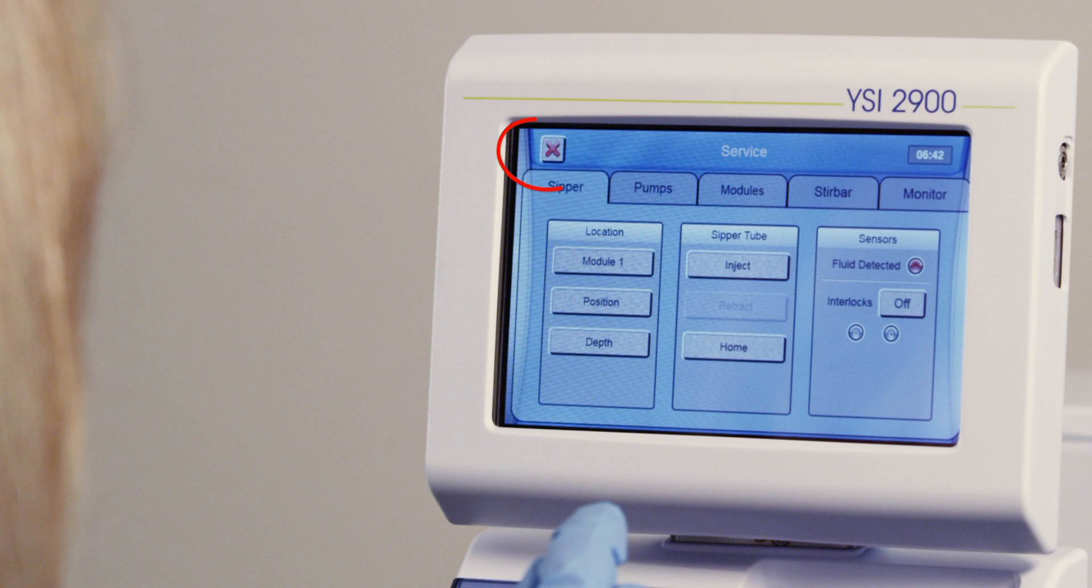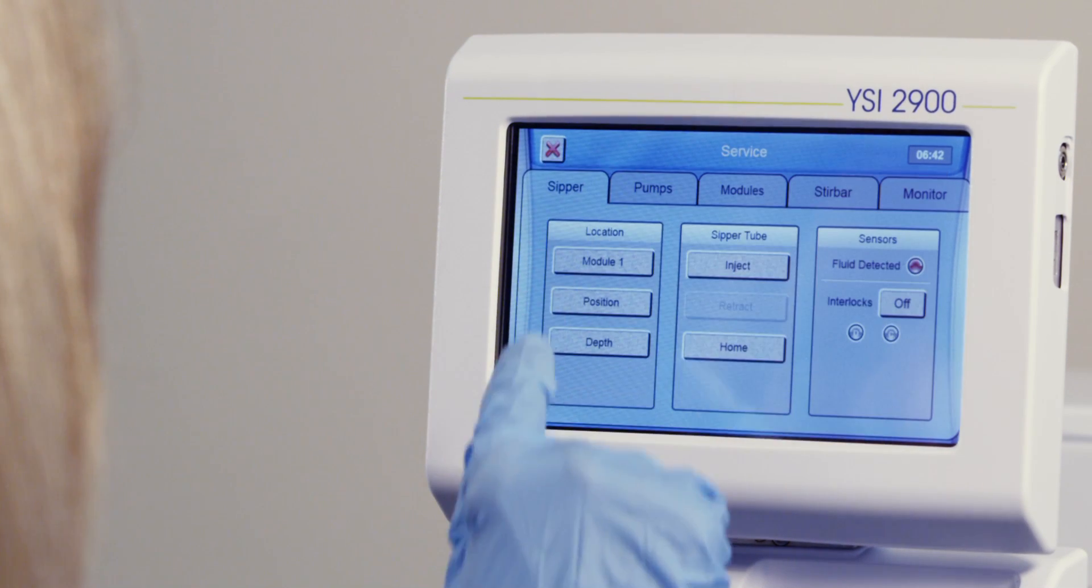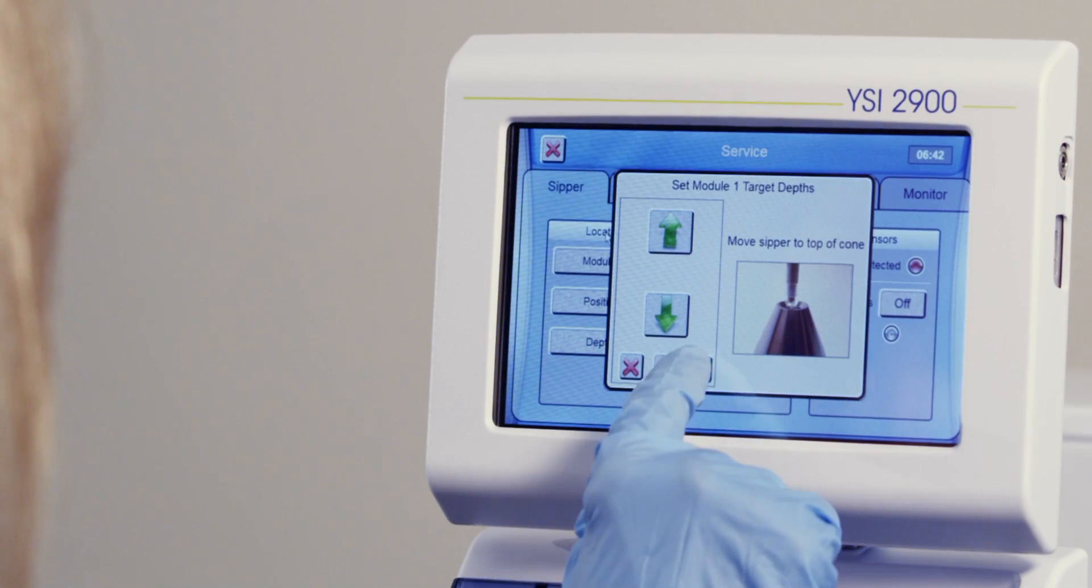To exit without saving, press the red X. To raise and lower the sipper, press the depth button, then press the arrow keys to adjust.